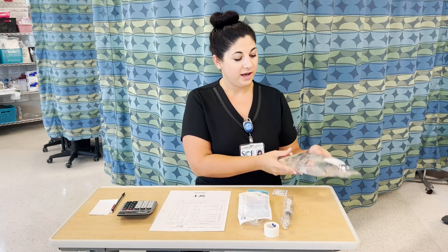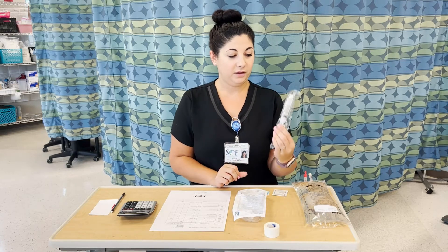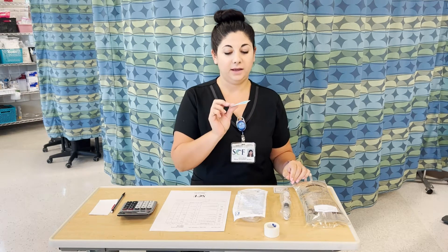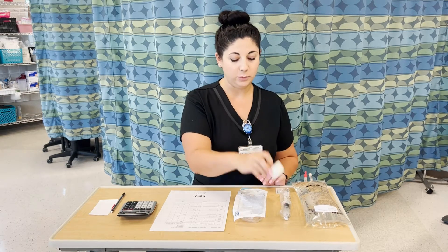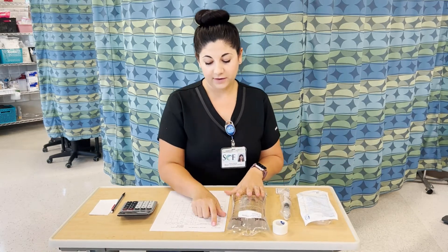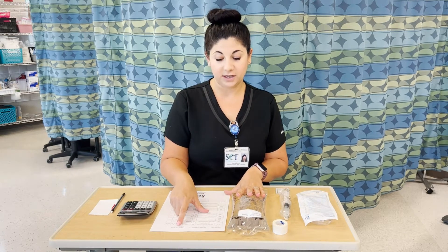I have my IV fluids, I have my tubing — primary tubing — a flush, alcohol swab, a label for my tubing, and tape. I'm going to do my second check against my MAR, verifying that I have the correct patient and checking their name and their date of birth, and checking their allergies.